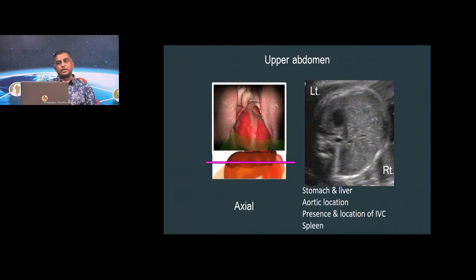This is a cephalic presentation. The head is in the lower pole of the uterus and the breech is in the fundus. So in this orientation, I know my left is this, my right is this, if I put myself in the fetal position, and therefore the fetal left and fetal right. After having allotted the sides to the fetus, I'm going to look at the transverse section of the abdomen and simply allot the sides which are being taken by certain key structures.